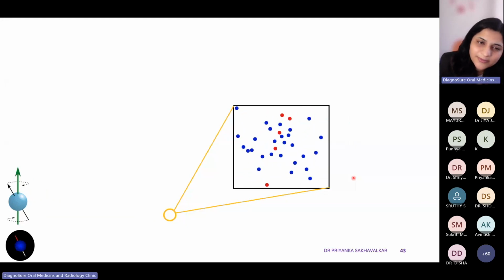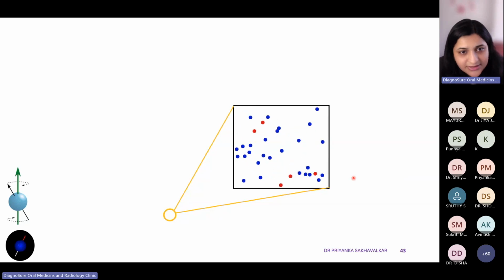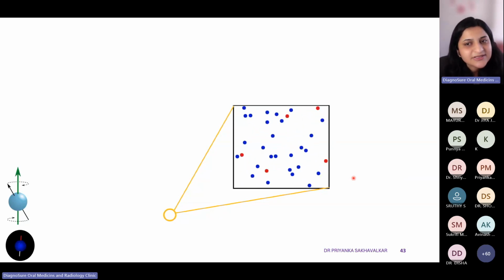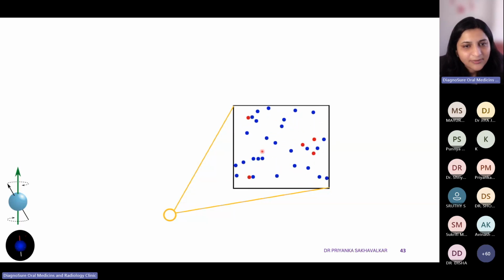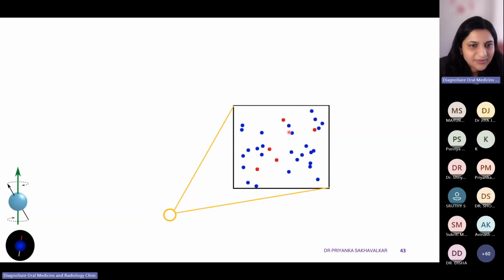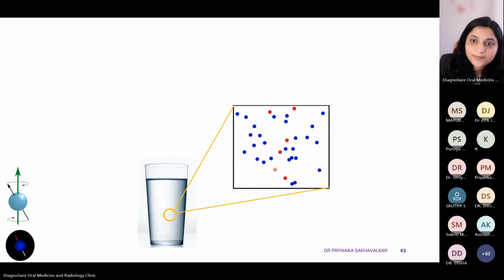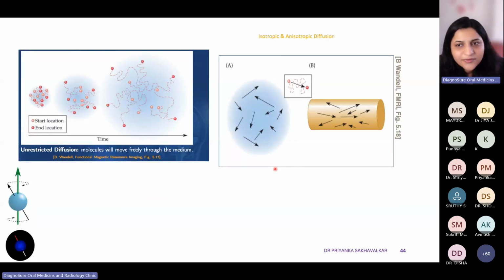Now, going into a bit more detail of diffusion MRI, you might all be aware of the diffusion phenomenon. Self-diffusion is the diffusion of a substance in itself. It is a biophysical mechanism based on microscopic random translational motion of water molecules in biological tissues. The magnitude of this motion is characterized by the apparent diffusion coefficient. These water particles are randomly moving, and this is known as Brownian motion.